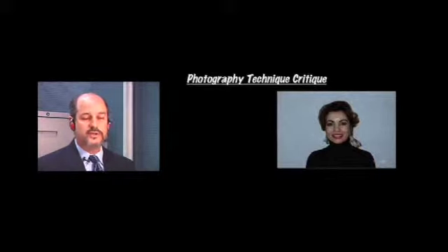I had several slides in here that show some errors in the pictures, but let's at least look at this one. Most of the errors, one was a fogged mirror, just to give you an idea. One of the images I showed incorrectly was just a fogged mirror. Obviously you can't diagnose from that, so that's incorrect. Some of the other ones were not getting the incisal plane or the occlusal plane, the posterior, being canted. So that was an issue.